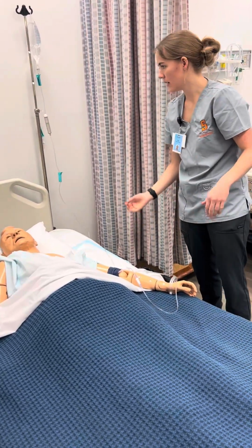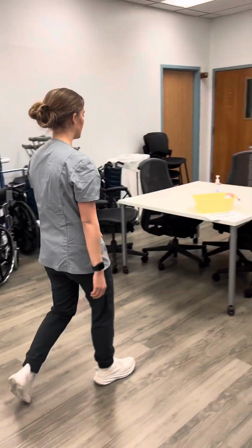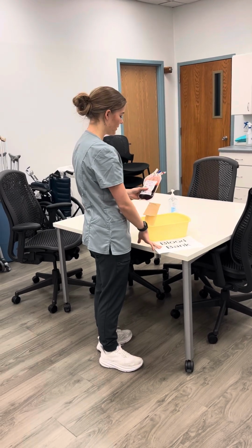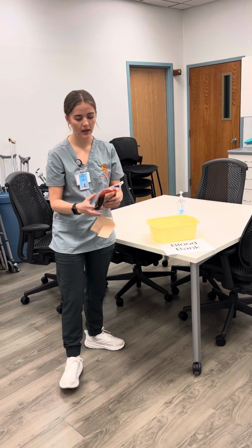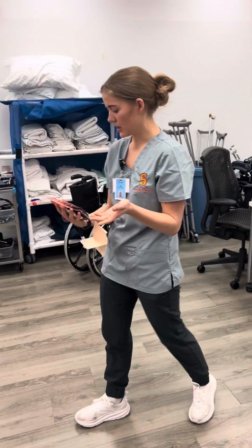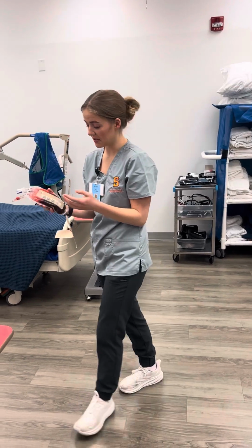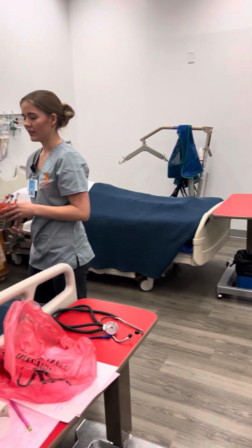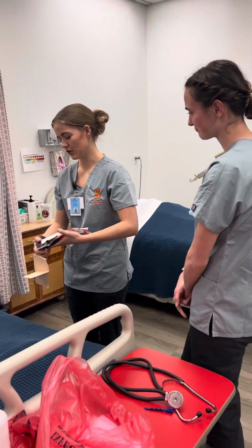Okay. Now I'm gonna go ahead and go to the blood bank and grab my blood. While I'm here, I'm just gonna double check with the blood bank that we've got the right blood, the right patient, all that, and that looks good. And I'm just gonna observe it, make sure there's no bubbles or cloudiness, and the color looks good. Everything looks great about this. And so now I'm gonna go ahead and have my other nurse come and just double check this with me.